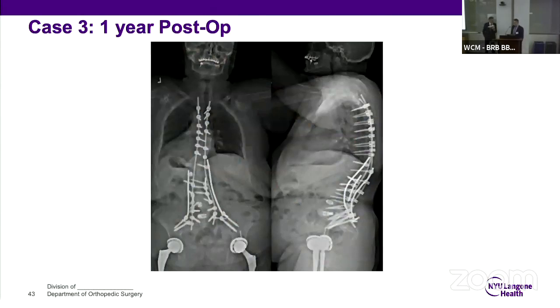It's the best, because otherwise the robot gets confused, or a navigated pre-op CT to intraoperative fluoro will get confused and will lead to inaccuracy. Not to mention that frequently these patients have osteoporosis, so you need something that gives you a powerful, high dose intraoperative 3-dimensional image for that. You're absolutely right.